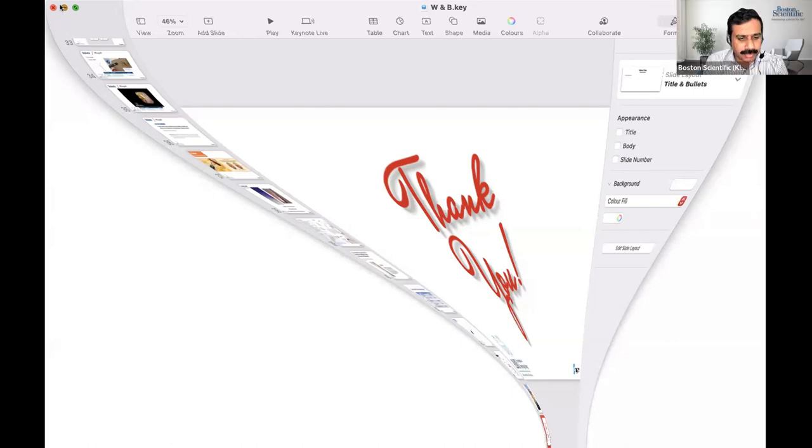Sure, sir. One more question: any specific application of stainless steel guide wires in your practice? I don't use stainless steel guide wires, at least these days. But I guess in situations where the ureteric obstructions are very dense, densely fibrous, where the ureter is badly damaged and you're not able to get through. But as much as I say that, these stainless steel guide wires can equally be traumatic. So it's tricky to say that they can hold on the shaft and caliber of the ureter and go through an obstruction better. It can also be traumatic. To be frank, I don't use stainless steel guide wires.